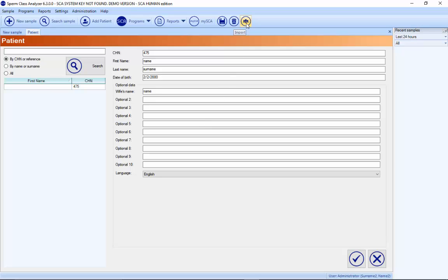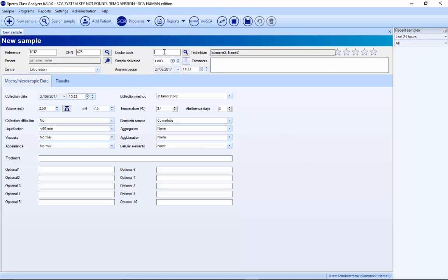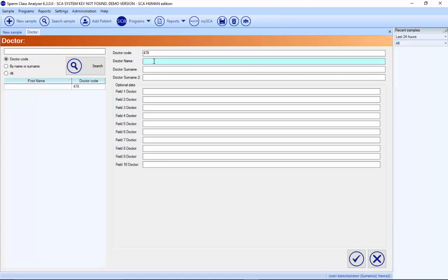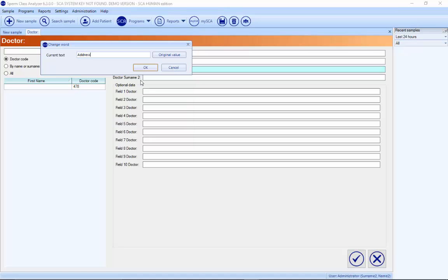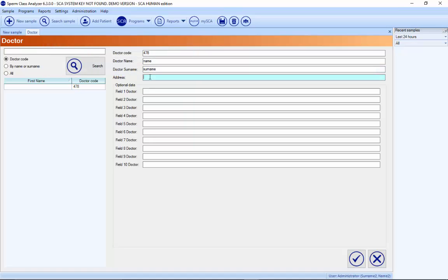It's also possible to import all patients from an Excel file directly into your database, or to connect the SCA database with the LIS system of your hospital. It's also possible to add a new doctor here — write the name, the surname. All fields are customizable; for example, you can add an address field and customize all these fields by pressing the right mouse button.